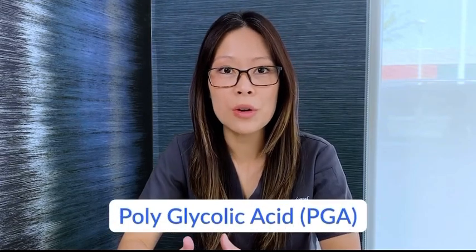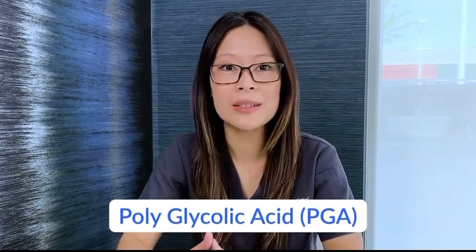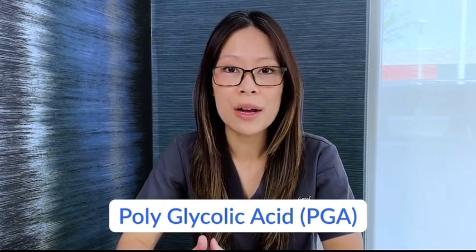Two common materials for absorbable threads are gut, which is derived from sheep or bovine intestine, and polyglycolic acid sutures, or PGA for short. Gut-derived material is natural, whereas PGA is synthetic.